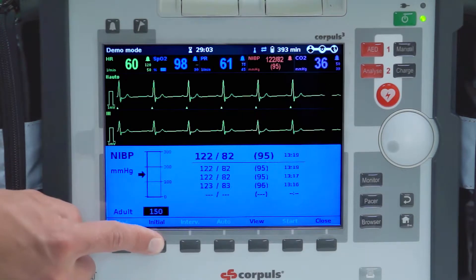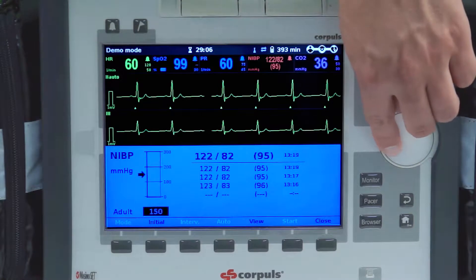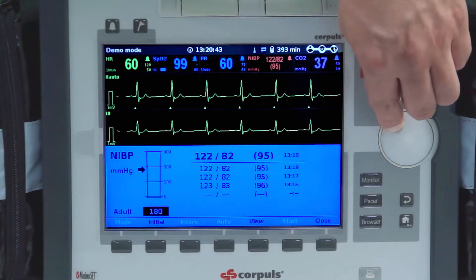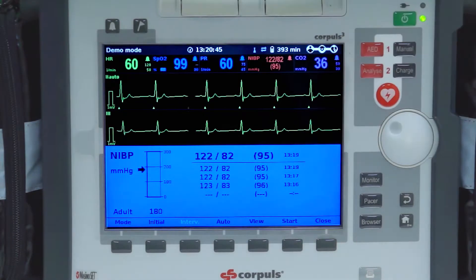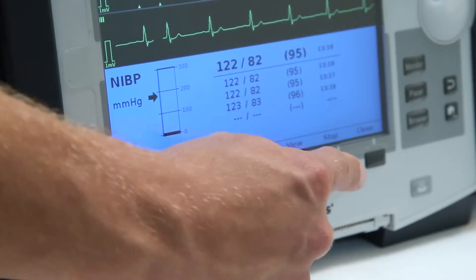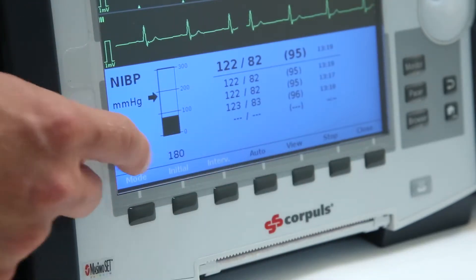Should the initial cuff pressure need to be adjusted, the user can press initial and then move the jog dial up or down. Press down on the dial to confirm the desired initial pressure. To start the NIBP measurements, press the start key at the bottom of the screen.